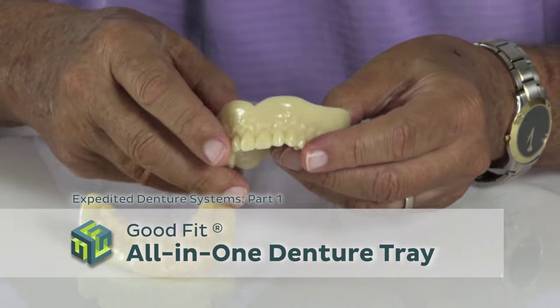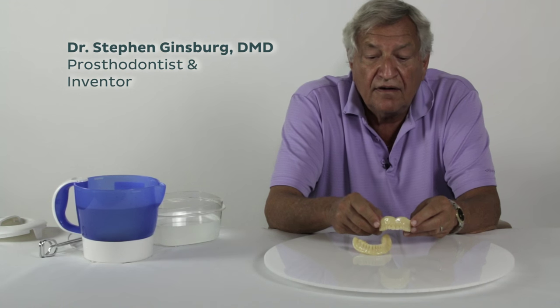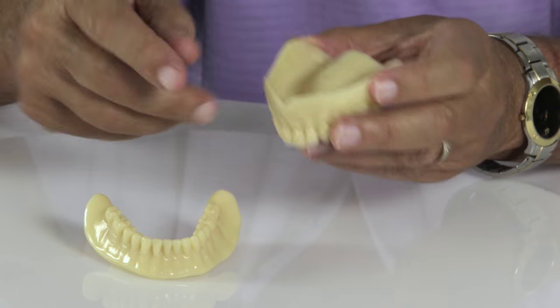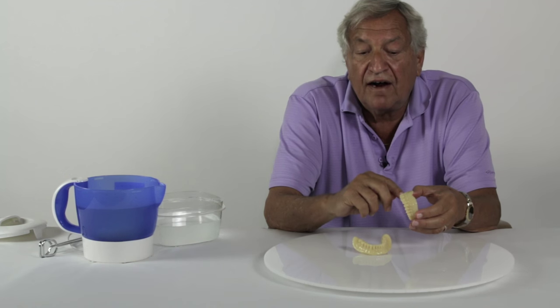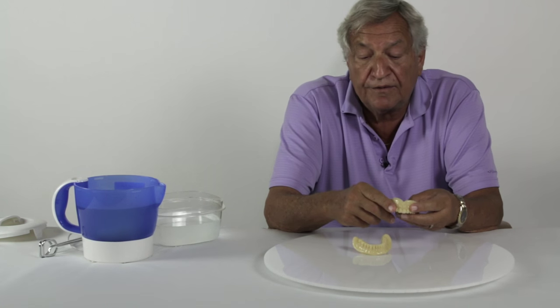These are the GoodFit all-in-one denture trays. They are the main clinical component of the GoodFit expedited denture system. They come in three base sizes, and on each base size there are different arrangements of teeth. There are actually six tooth arrangements altogether.